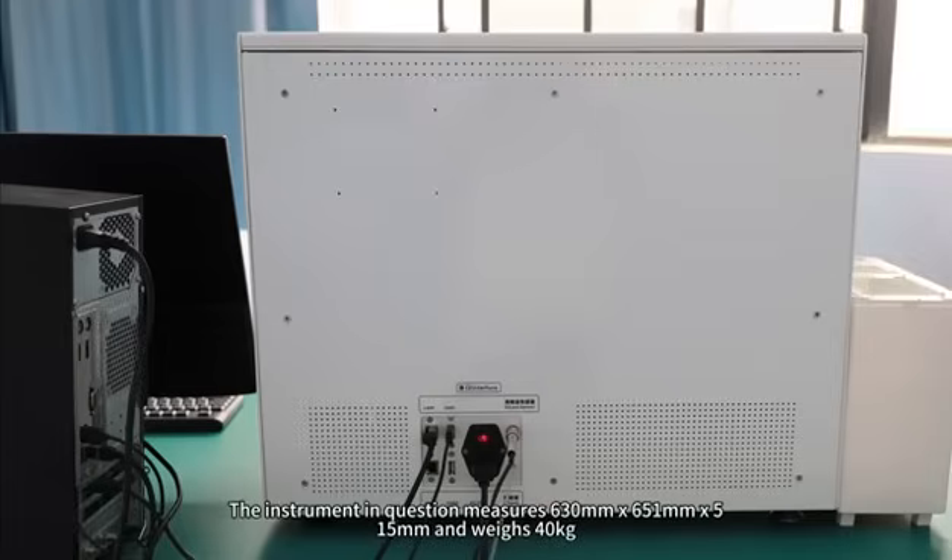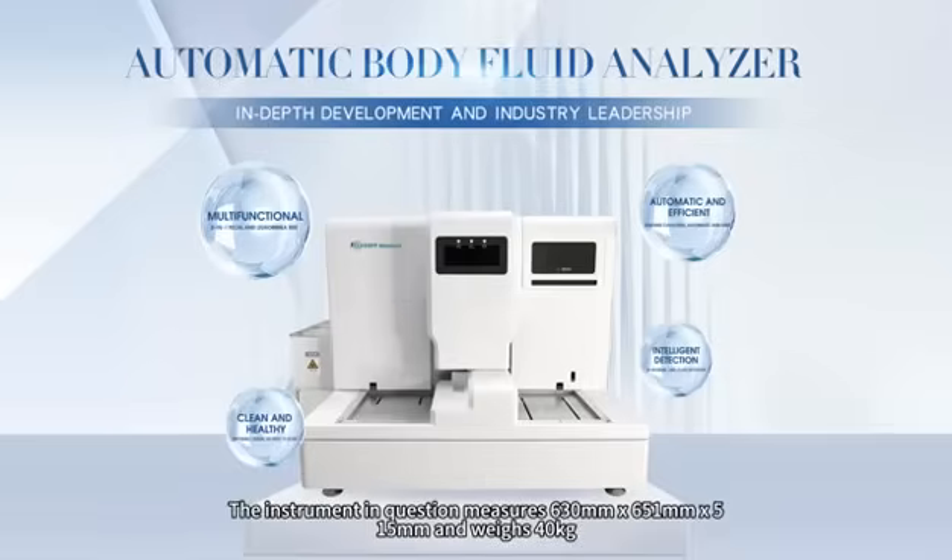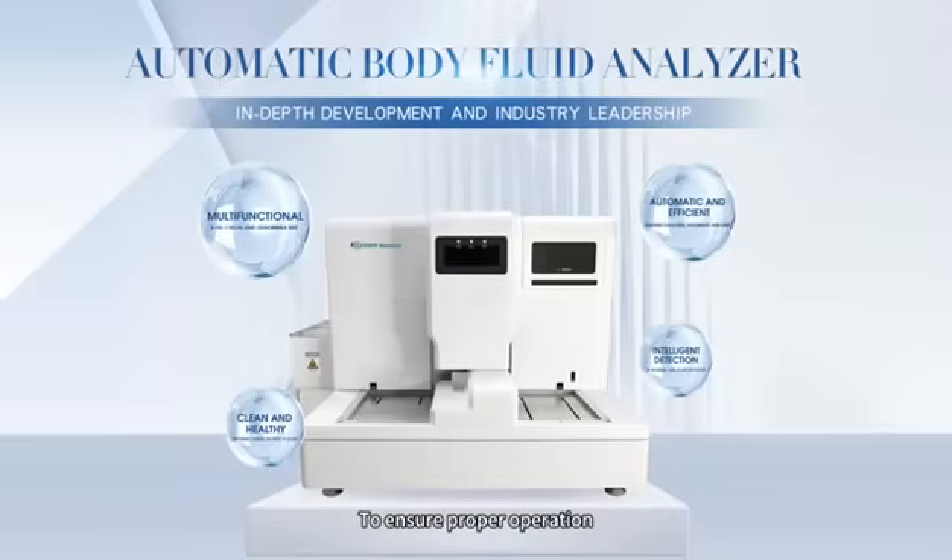The instrument measures 630mm x 651mm x 515mm and weighs 40 kilograms. To ensure proper operation, please place this device on a suitable workbench.